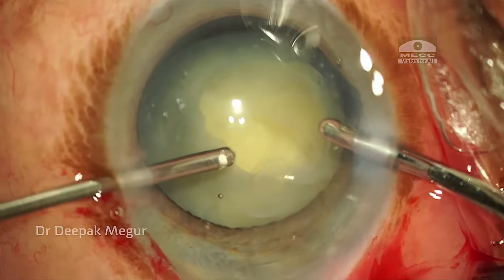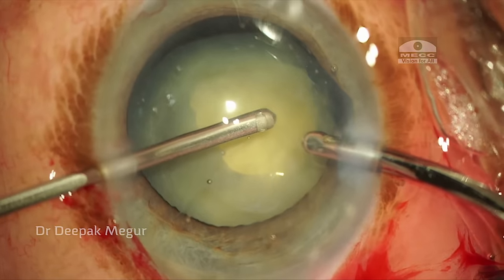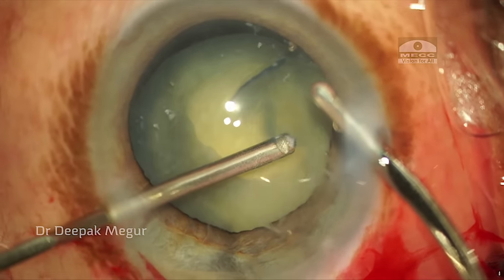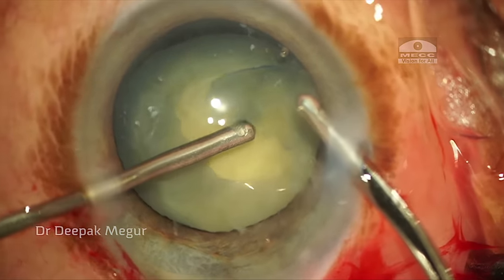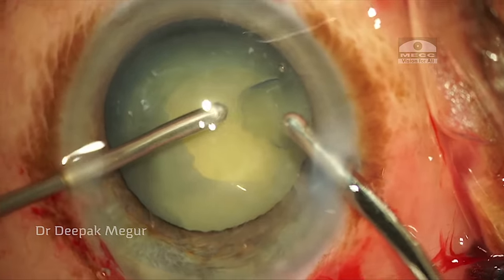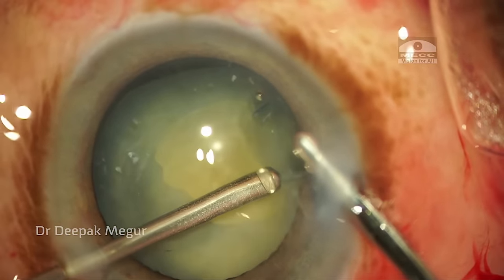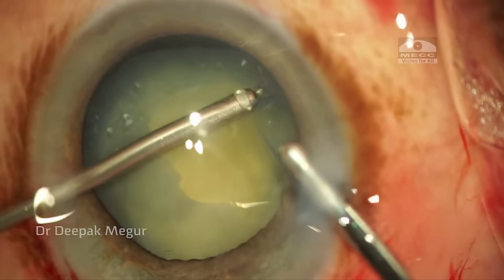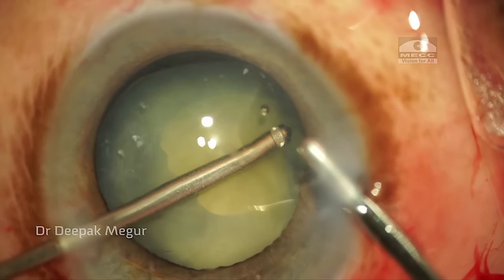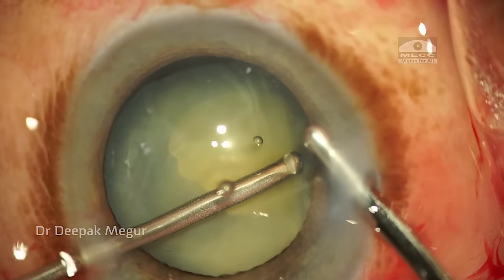Now to take care of the capsular flap remaining in the danger zone, I am using a vitrector. This is my preferred technique to deal with capsules in the area of weak zonules — the idea is we can cut the capsule without causing any stress on the zonules. I am using a high cut rate, low flow rate, and moderate vacuum to gently nibble at the capsule and take care of the flap without inducing any stress on the zonules.